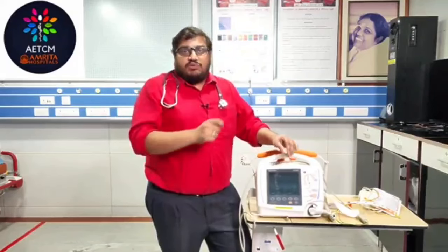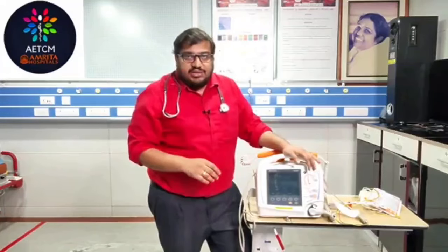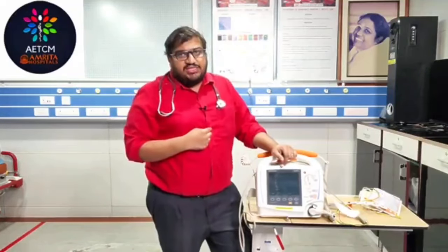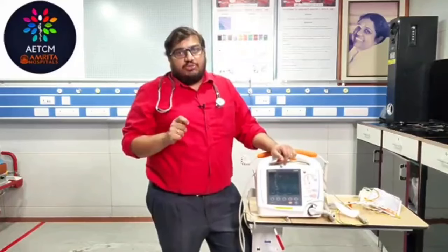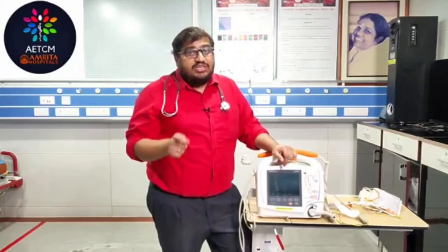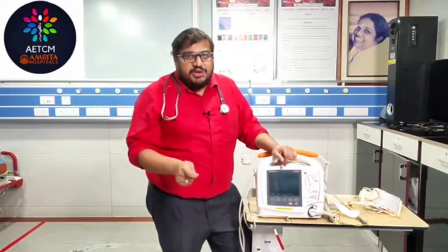First thing is that you have to select the amount of energy, and you have to make sure these paddles are connected, and you apply adequate gel over your paddles. The next thing that you need to remember is that you need to shout that everybody should be clear, not touching the patient. You are going to apply a direct current. Nobody should be touching the patient.